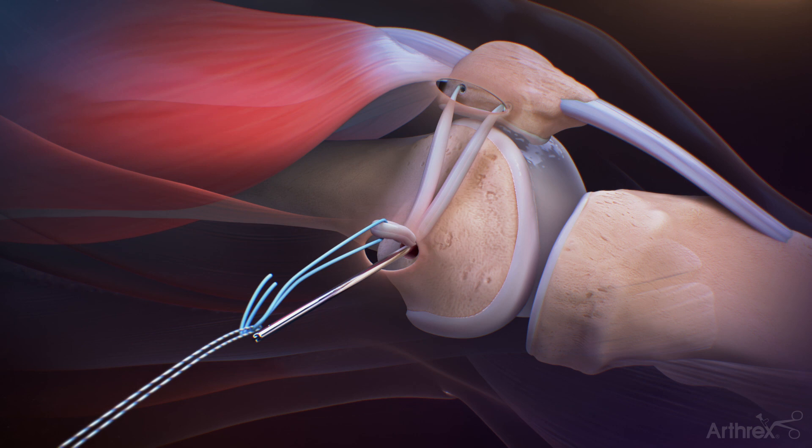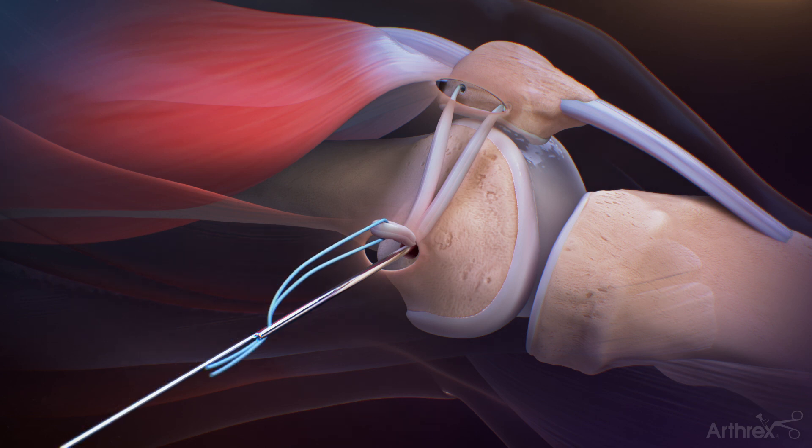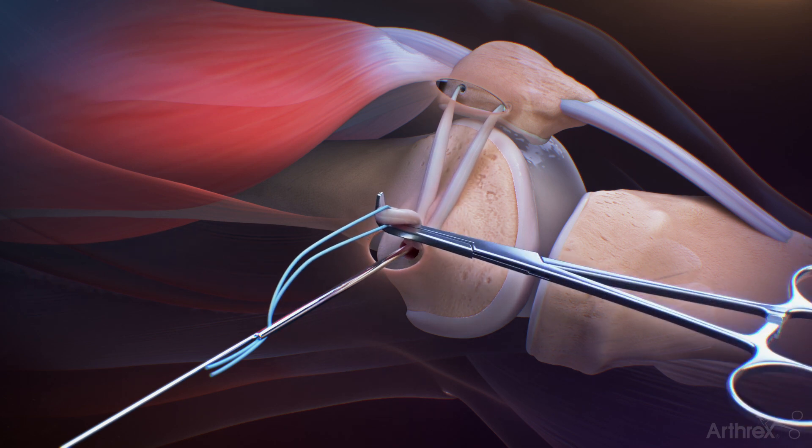Deliver the sutures out of the medial femoral incision with equal tension on both graft bundles. Place a 1.1 mm nitinol guide wire into the femoral socket next to the 2.4 mm femoral drill pin. Loop the blue No. 2 fiber wire graft sutures into the eyelet of the 2.4 mm femoral drill pin and deliver the suture tails out of the lateral femur prior to the graft entering the socket.